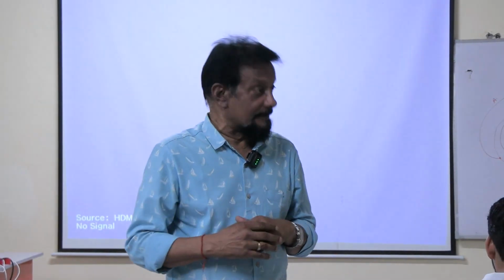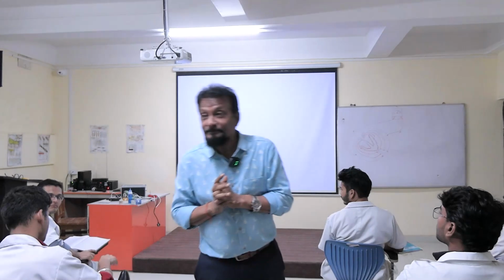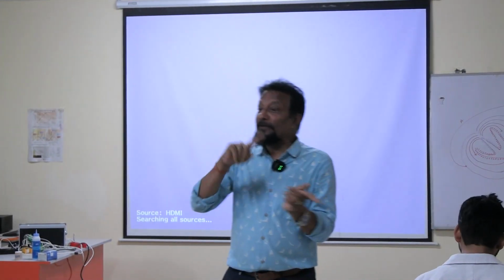You can also identify enlargement of the heart, hypertrophy of the heart. But you cannot diagnose any valvular disease with this. Which valve is affected? How can you diagnose? That will be indirect, not direct. Because of the valve disease, some enlargement will be there, but for enlargement the causes may be different.